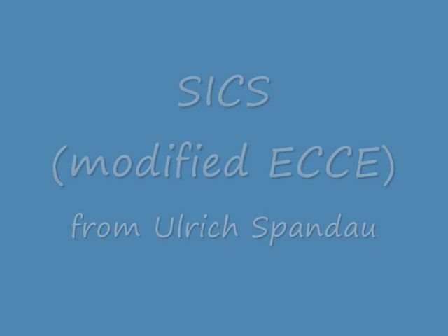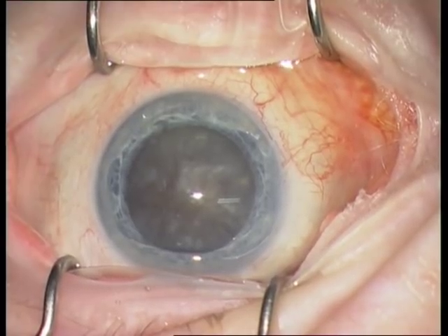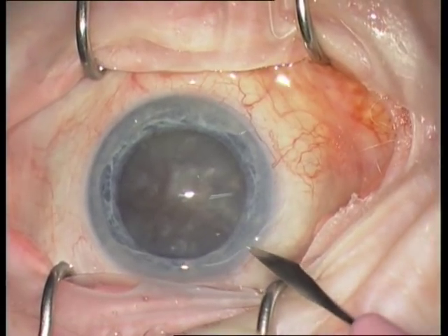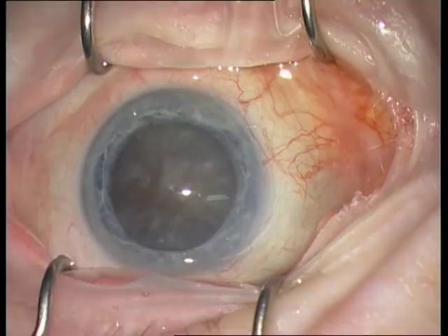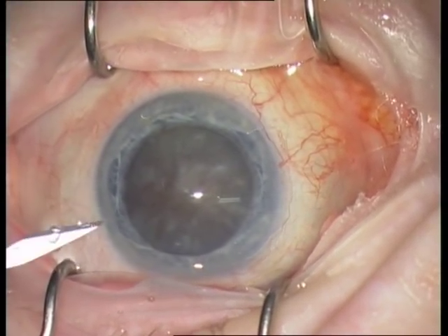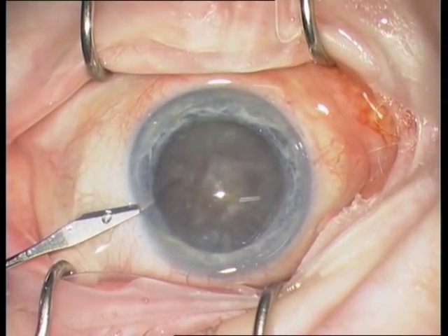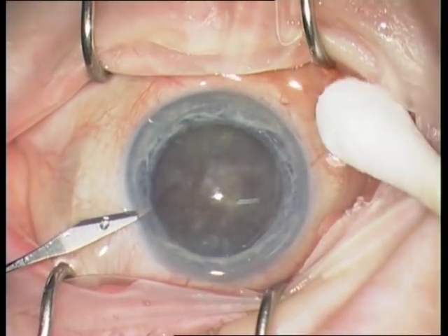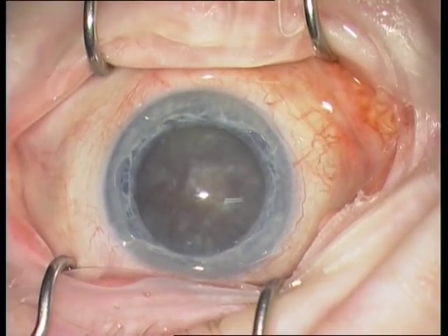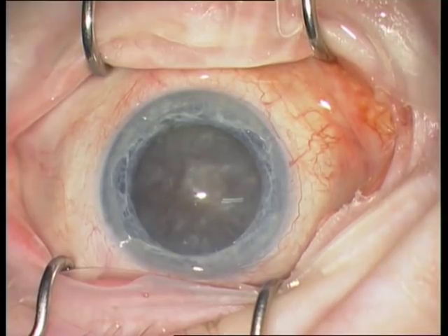I will demonstrate a cataract operated with the SICS technique. SICS stands for Small Incision Cataract Surgery and is a modified ECCE technique. The SICS technique is widely employed in Asia and Africa. This female patient is 94 years old, the nucleus is rock hard and the visual acuity is light perception.